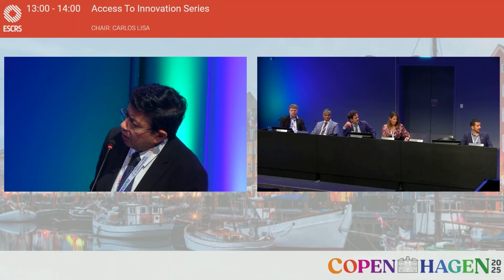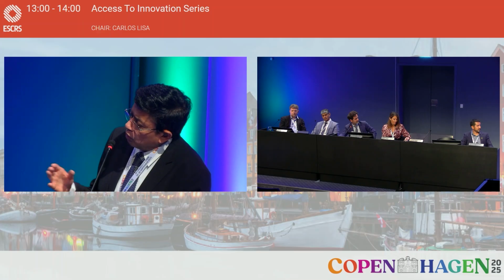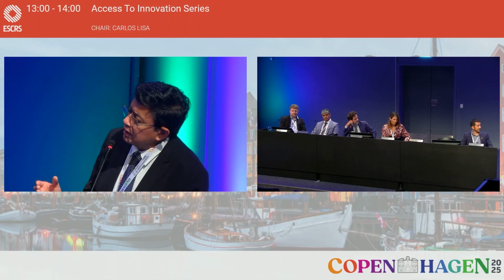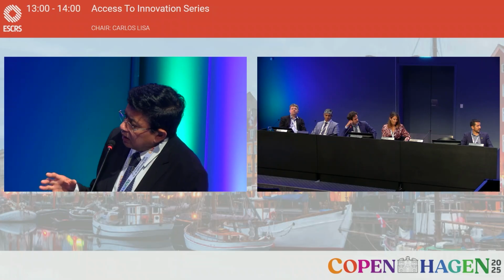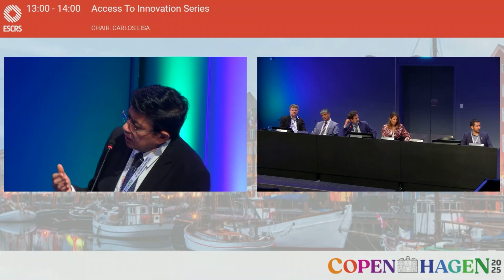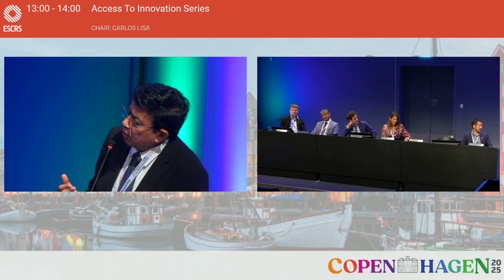So essentially, we are constantly looking for a lens which could give us a range of vision from distance to near, with quality of vision that's comparable to a monofocal intraocular lens. Obviously, we are not there yet, and I think this lens is a progression in that step. It does not have any diffractive rings, it has a unique refractive pattern with the distribution of the power in combination with positive spherical aberration, allowing it to give you a range of vision with a mild compromise as far as the quality of vision is concerned.